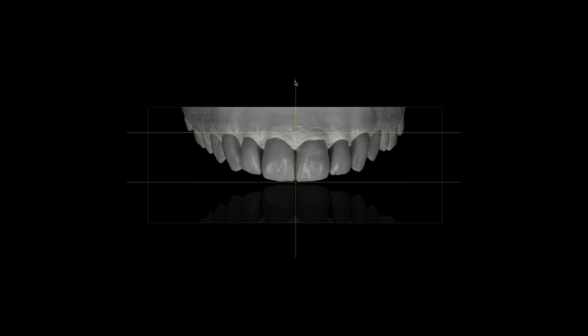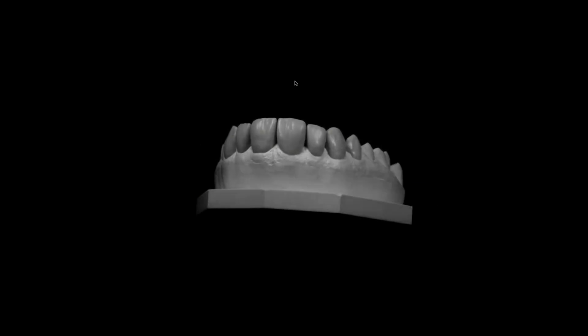You can see now when I add this incisor line, they are almost symmetrical, but I try not to always do exactly like a mirror. I always like to do it a little bit twisted, a little bit one over the other, and you will see later. So this is the final result.